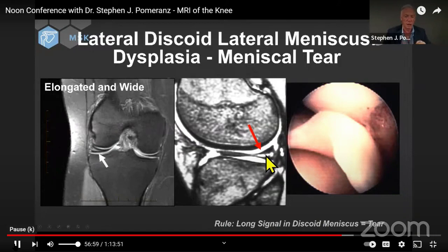What do you do about it? Nothing until it ruptures. This patient had locking. Our hand was forced. This was coming apart, back together, coming apart, back together. We know that from the physical exam. There was audible clunking. The meniscus looked pretty good from the outside at first glance. It was convex upward, but when we took it out and put it on the table, we had to do a total meniscectomy. It kind of fell apart into two pieces.